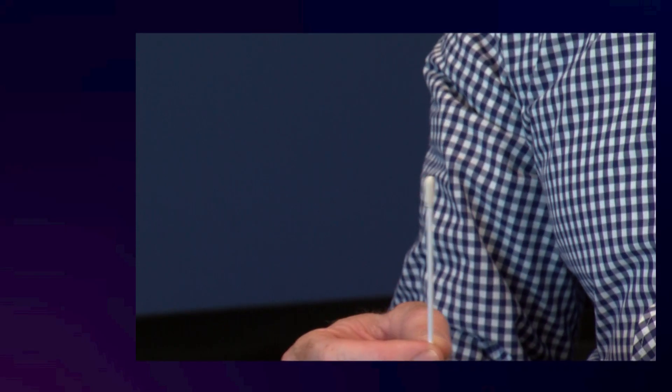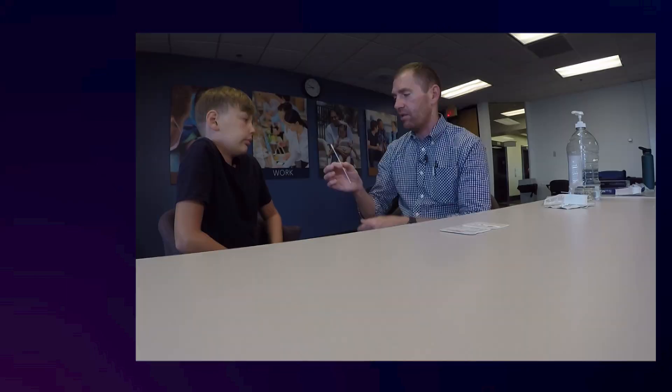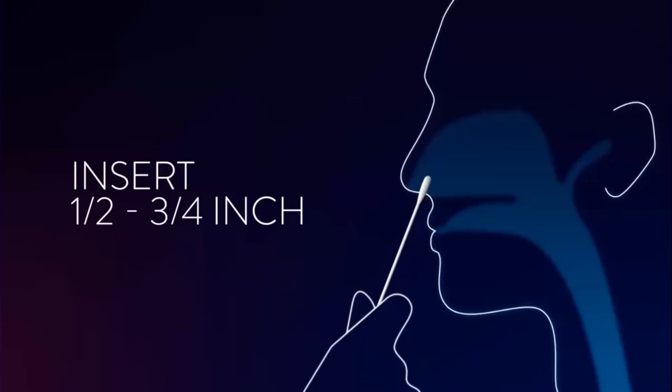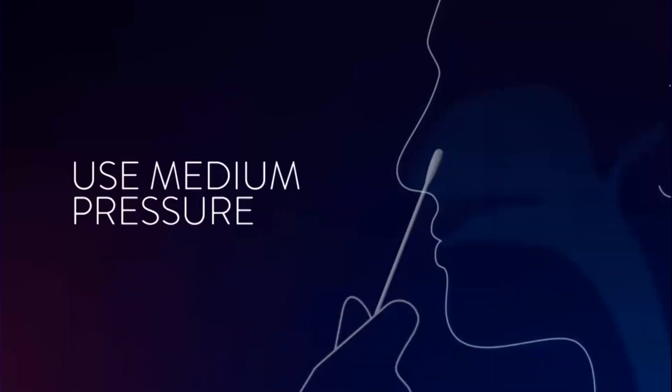We're going to insert the tip of the Q-tip just inside your nose on both sides. We're going to start here on the left side. Just inside the nose, and we're going to do a couple of circles. Just to the tip of that swab.